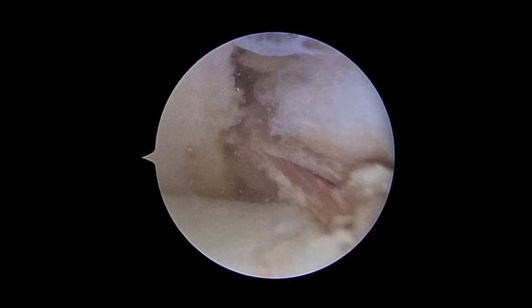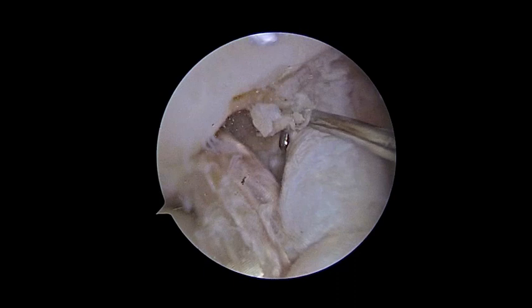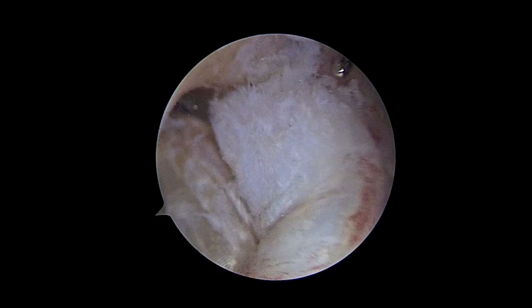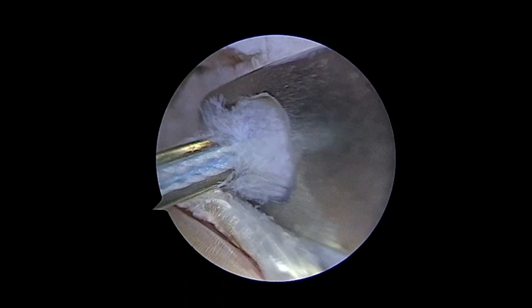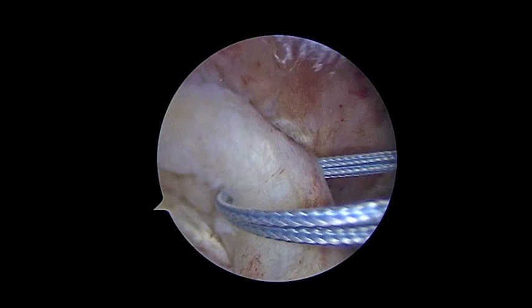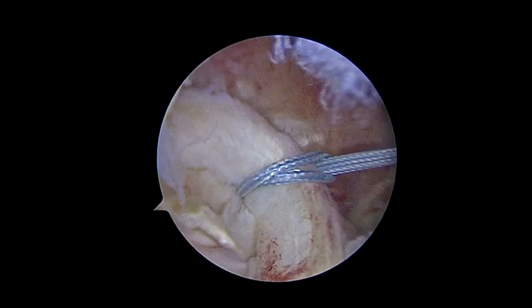We pass the graft from the tibia to the femur with sutures and fix it on the femur with a TightRope. You see the graft position and the right red remnant. We start to put a stitch in the remnant with the Scorpion, starting at the half of the stump using FiberWire number two, like a cinch.